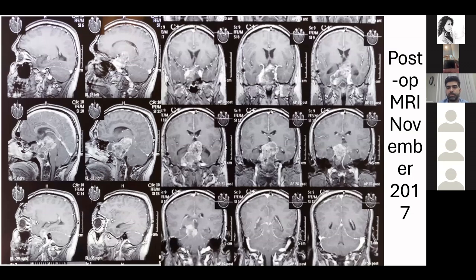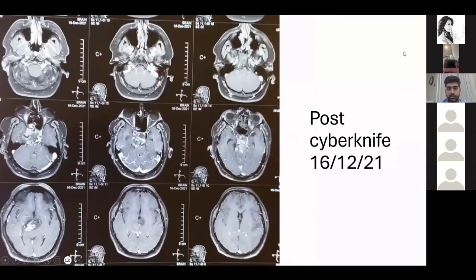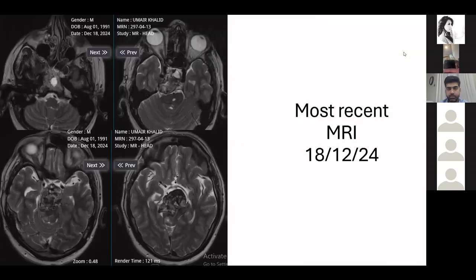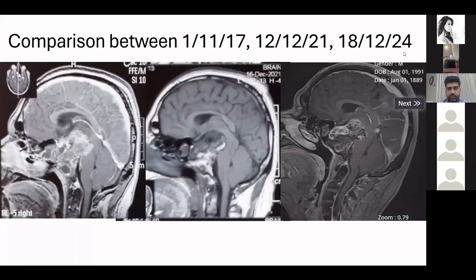So here you can appreciate a little better that on post-contrast sagittal T1 weighted images, the lesion was largest, obviously, in the first provided image, but then the enhancing component has decreased, although there is still mass effect and still residual mass, but the enhancement pattern has gradually decreased over a span of 6 to 7 years.